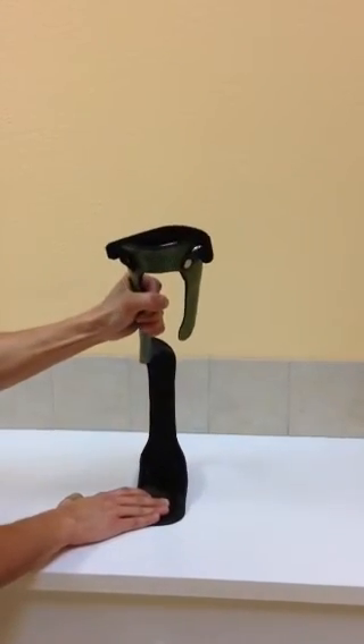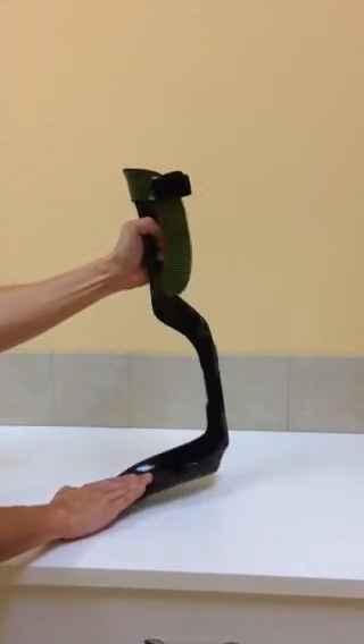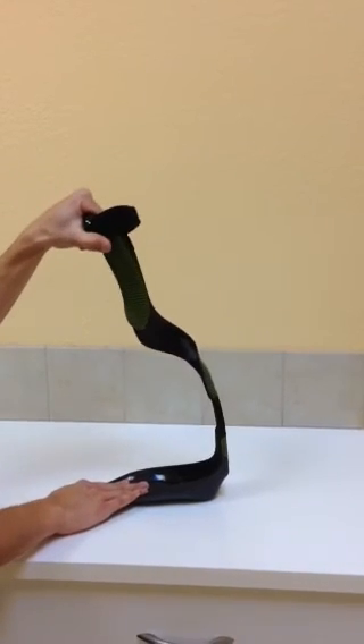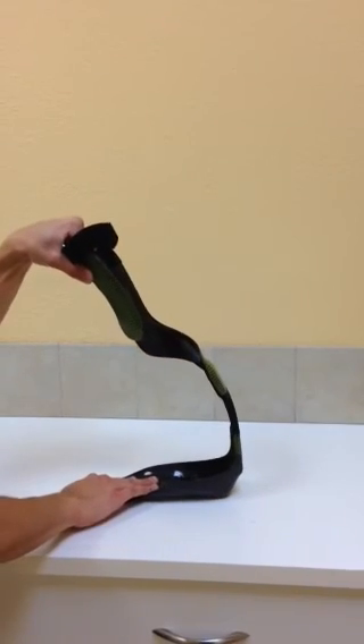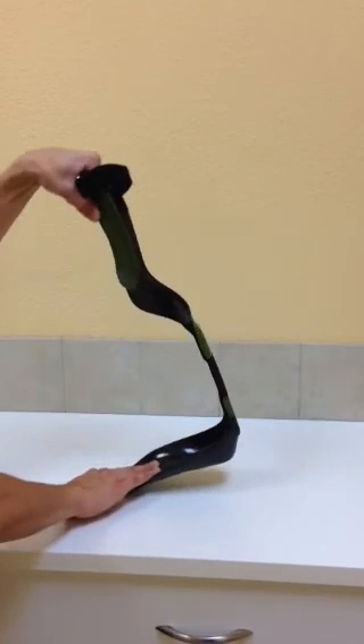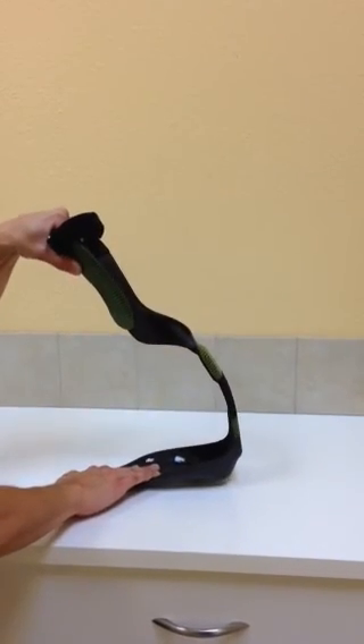Again, let's do it from the side and bend it as much as we can. And as you can see, this brace actually gives 40 to 50 percent more compression and flexion than any previous models we've had.